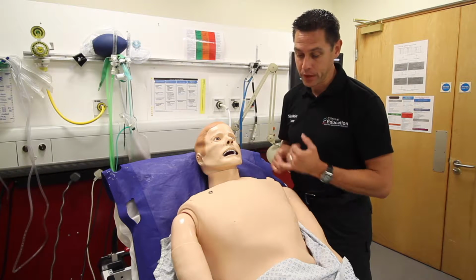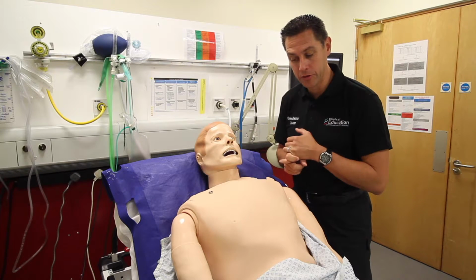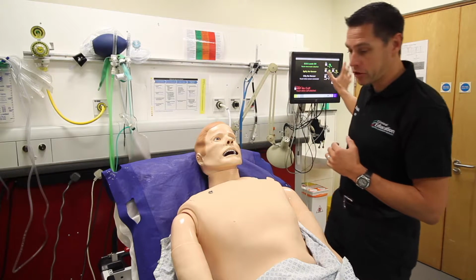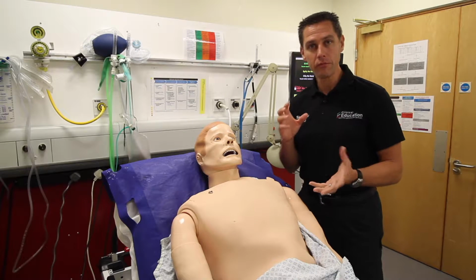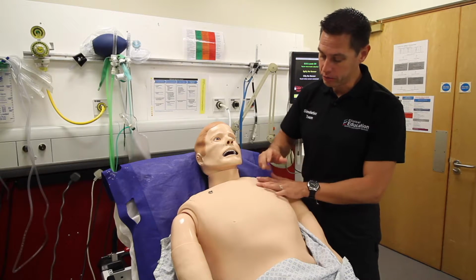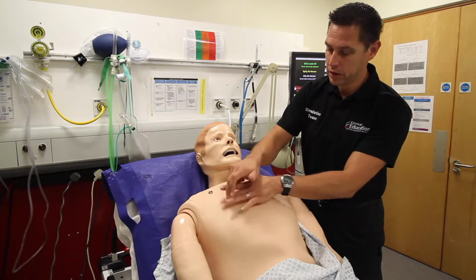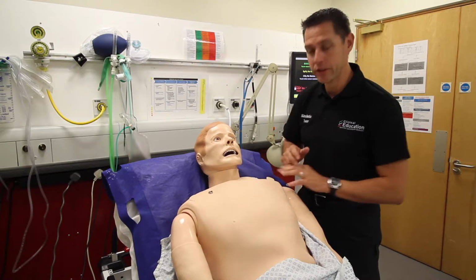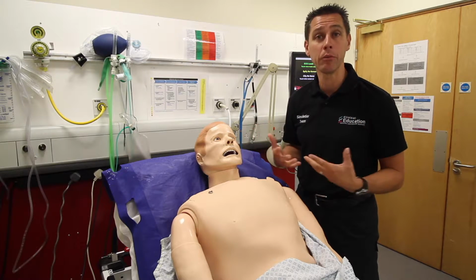His respiratory rate is in time with what it's set to, so you can stand and count his respiratory rate. Equally, it may be shown on the monitor that you'll see behind us in your scenario. Percussion note, so if you're going to examine his chest like you would do normally, the percussion note is always going to be dull because actually he's a plastic mannequin, so that information might come from the plant within the room, might give you a bit more detail on that.